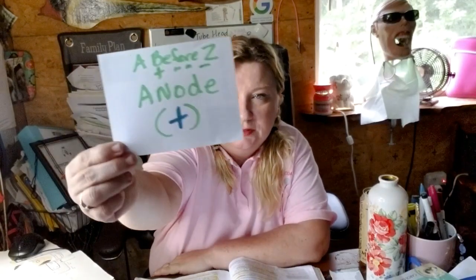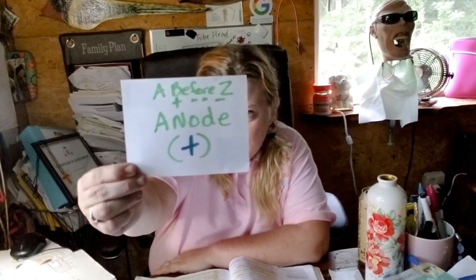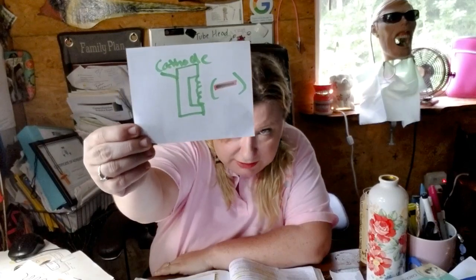Now, I want to review that anode is positive, okay? So you need to know that. Write that down. Anode is positive. Cathode is negative, okay? Now, another way to remember is A is before Z. That's a good way to remember it. And A is positive. So A is first, positive is plus, before minus. C comes after A, so just remember, positive, A plus. You're going to get an A plus on this exam. If anything, you're going to pass it.